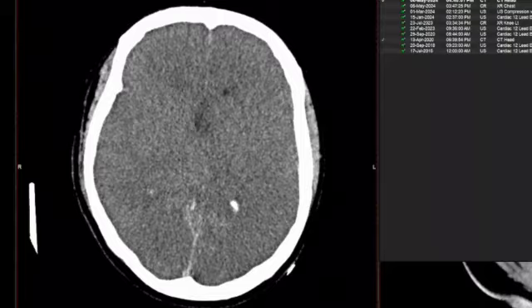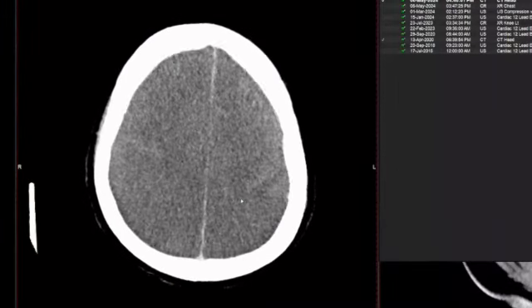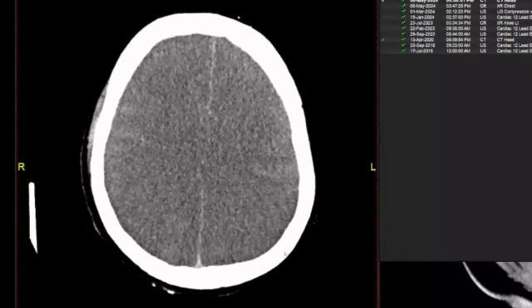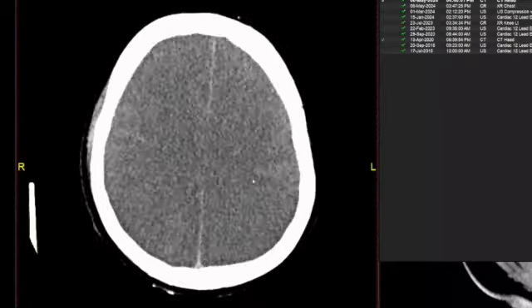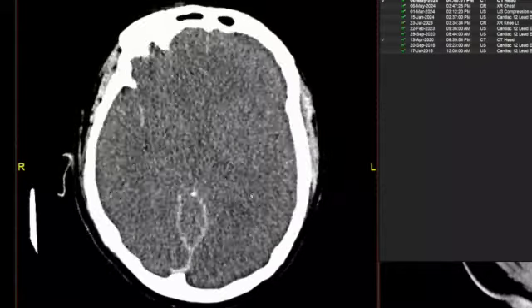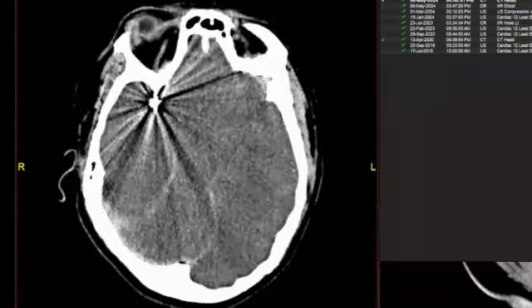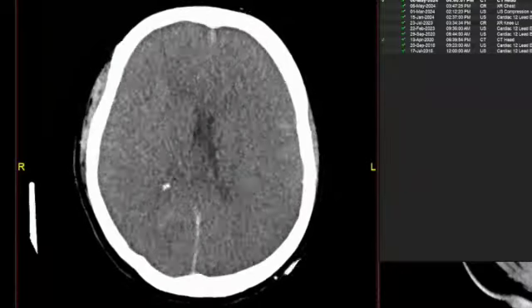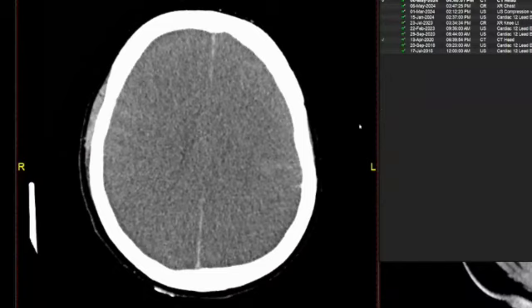So a similar picture to the last one. Again, the ones you do see were not a craniectomy center, so you typically see the same thing. So diffuse loss of grey white matter differentiation. She's 51, but you should still have some sulcation, and the very first case I showed you was a 56-year-old, albeit one with, I think, a bit too much atrophy, but you should have some sulcation. No sulcation, no grey white matter differentiation, ventricles are small. You can't discern any of those central grey matter structures. But again, it's really important to have this pre-scan, because you want to be sure you're not seeing any of these structures as dense because you've misinterpreted pre-existing density. So that was her control scan.